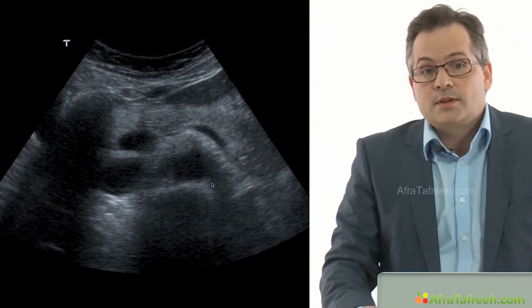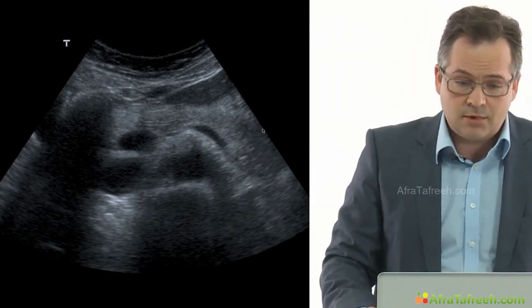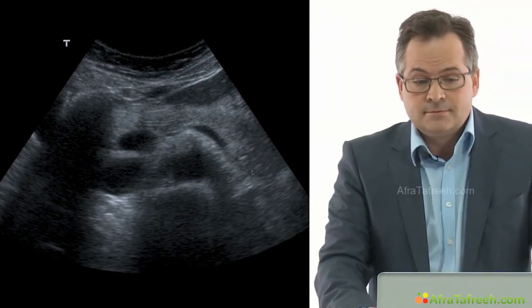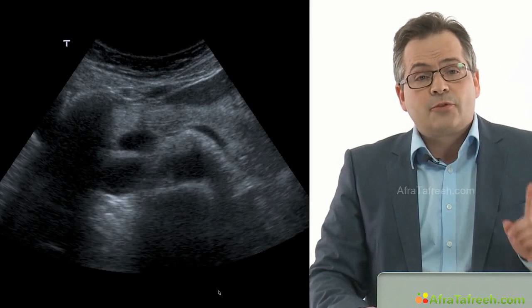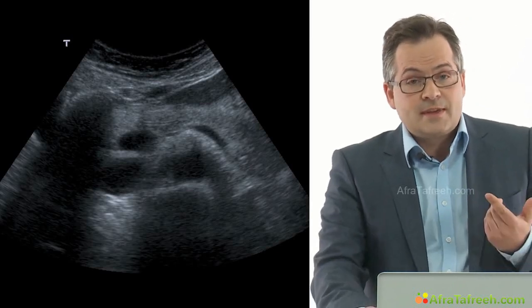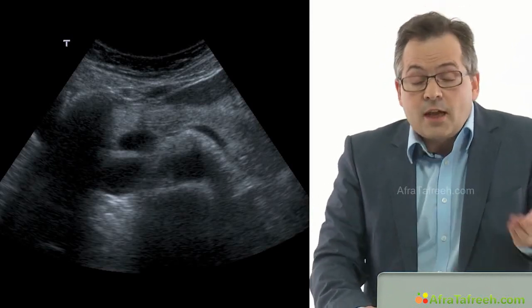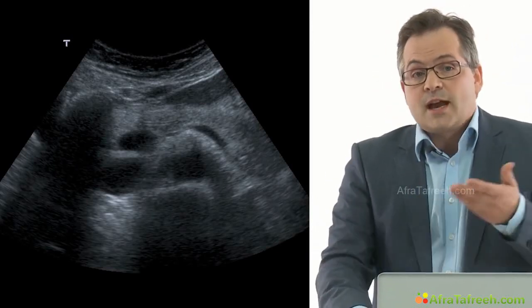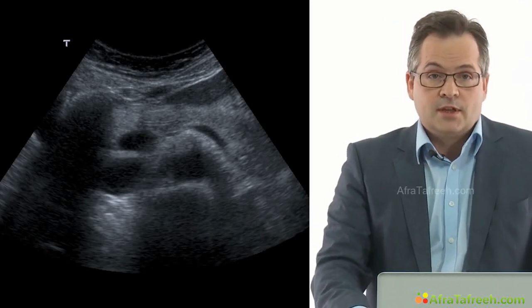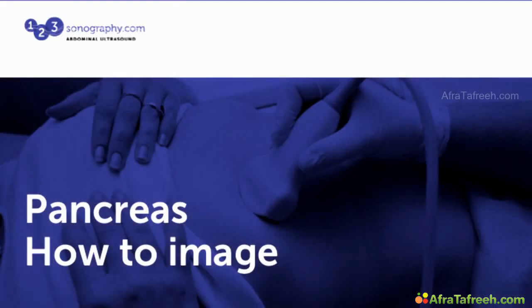So I asked my colleagues to help me, and they showed me something over here, and I said, okay, fine. I thought, no chance. But then I got the first information about what the problem is. There is no distinct echogenicity of this organ. In younger patients, it's darker, which means hypoechoic. In older ones, it's hyperechoic, meaning bright on the screen. And sometimes not even this is true. So a really hidden organ.